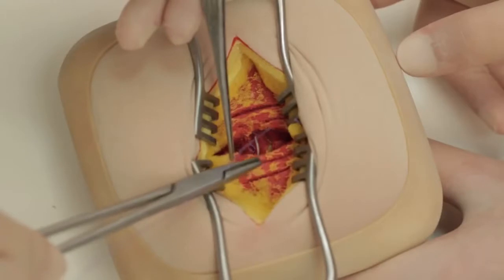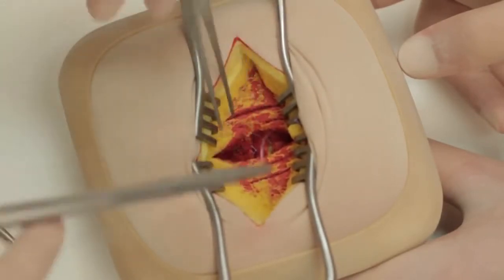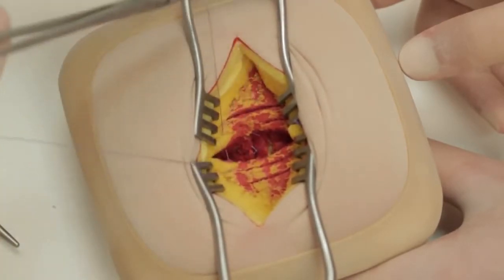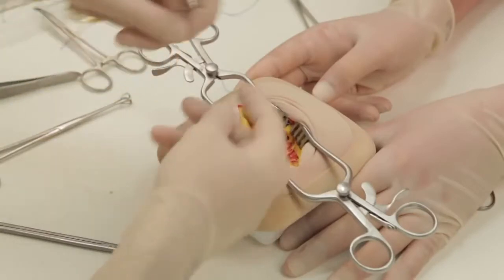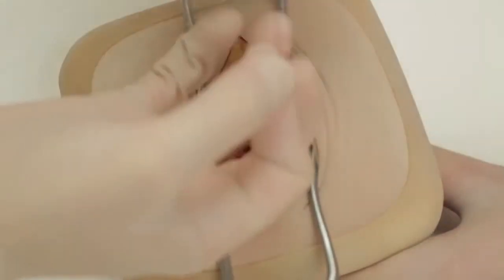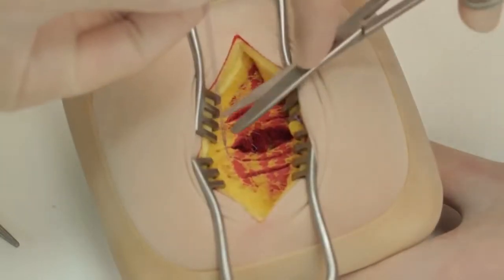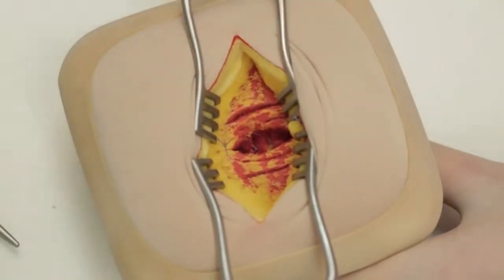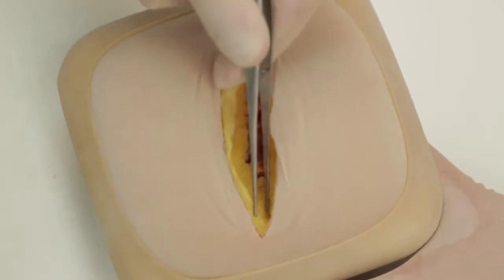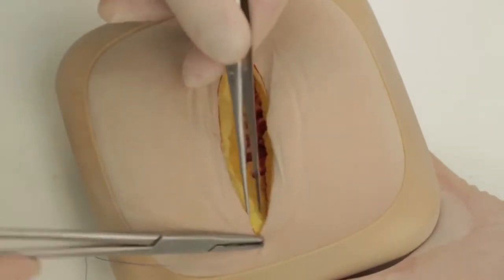External oblique is closed using a continuous stitch of 2-0 Vicryl. Scarpa's fascia can be closed using interrupted sutures.